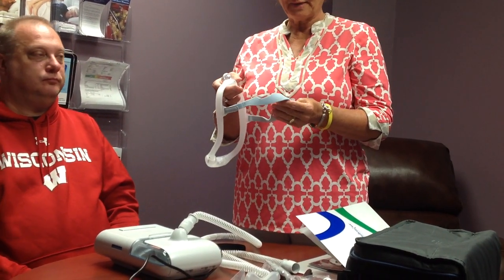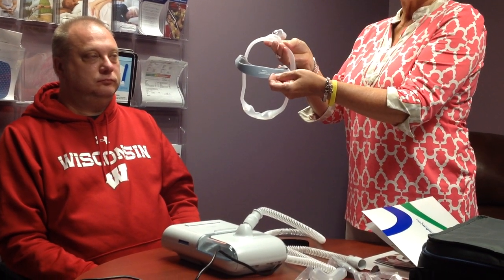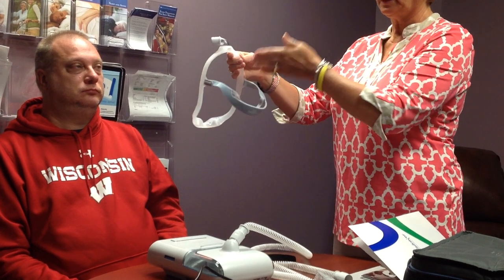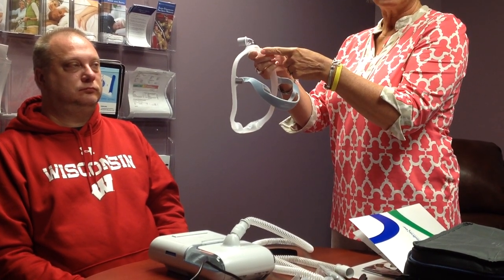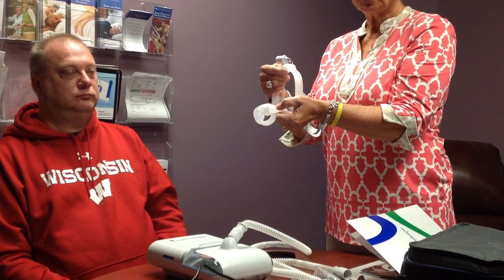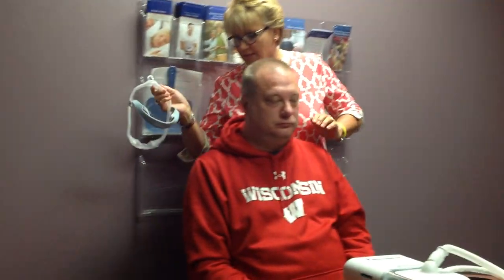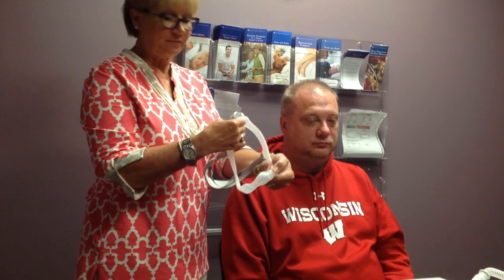When you're getting ready to put this mask on, the markers you always want to look for: that Philips Respironics label is upright. If it's upside down, you're putting it on the wrong way — always make sure the writing is upright. The other marker is the headgear, which is also sized. Almost everyone will be a medium headgear; if there is a problem we can always send out a different size. With Respironics, the size of the cushion will always be on the left side — always on your left side. So go into wherever there's a mirror, look at your markers: it's upright, I can see the medium, I have the size on the left.